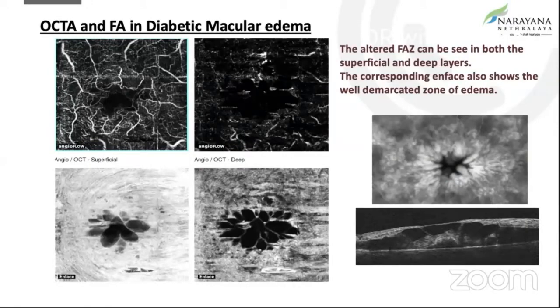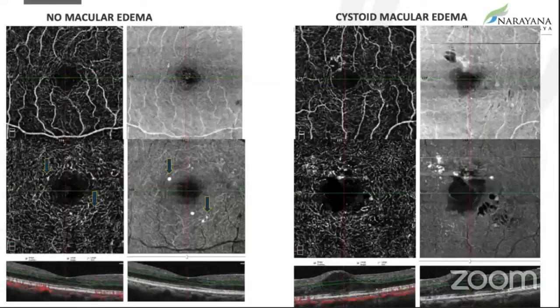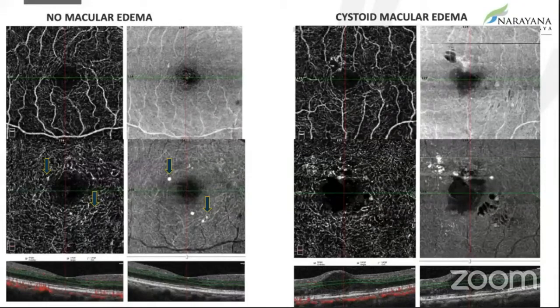Coming to the en-face image, that also shows us a lot of detail and is very well comparable to dye-based angiography, where we see the pattern in cystoid macular edema so beautifully. It can be seen in both the superficial and the deep layers, and the corresponding en-face also shows the edema. Comparing no macular edema with cystoid macular edema, we are able to see the manifestation across the different layers and in the en-face as well, as against a normal-looking FAZ with no edema.